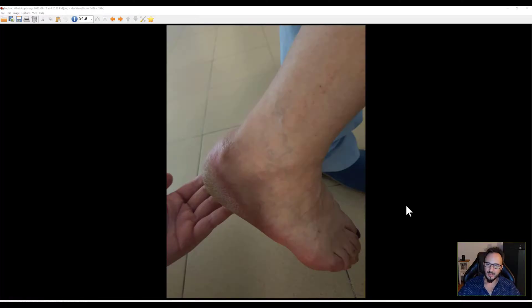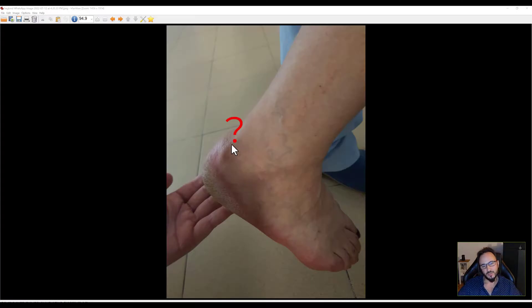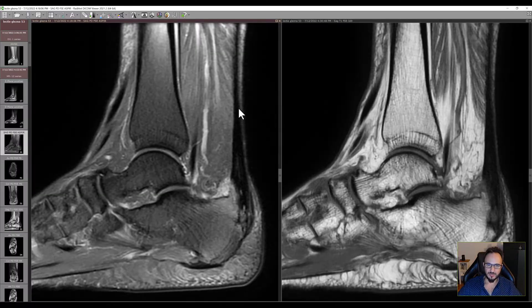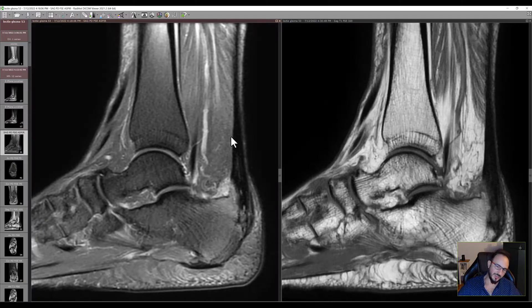Hello guys. This is a colleague from work who came for an MRI for this bump. She thought that this is a tumor and she was quite concerned. So, this is the MRI. What do you see here?